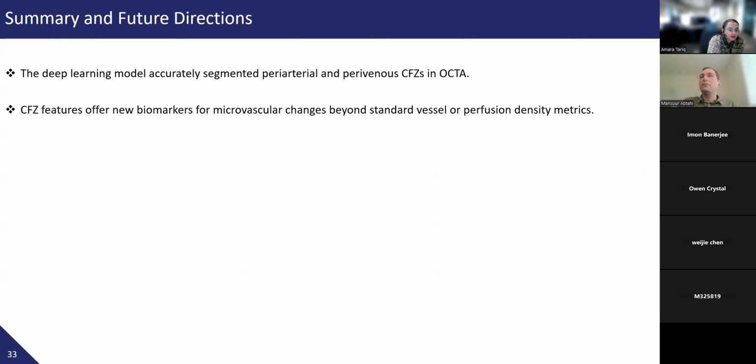We had some standard density metrics that give us some information about the different states, but generally they were not able to distinguish completely between the no DR and mild DR because, as I discussed earlier, the differences are very subtle.